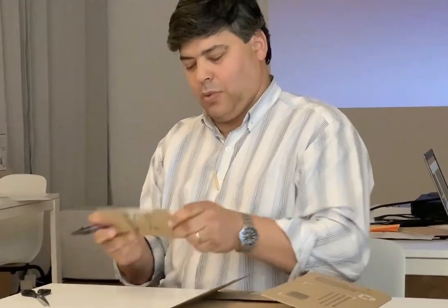This is anterior. So this side is anterior. I make also the fossa ovalis, posterior superior ring, posterior, posterior inferior, anterior inferior ring, anterior superior ring. Then we already received this here, the septal pouch that's connected. And then with the red dots, we represent the inferior right pulmonary vein and superior right pulmonary vein.